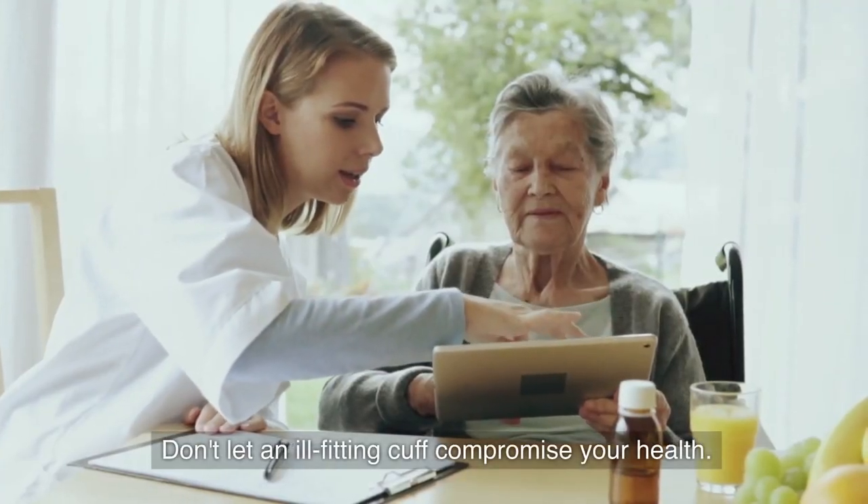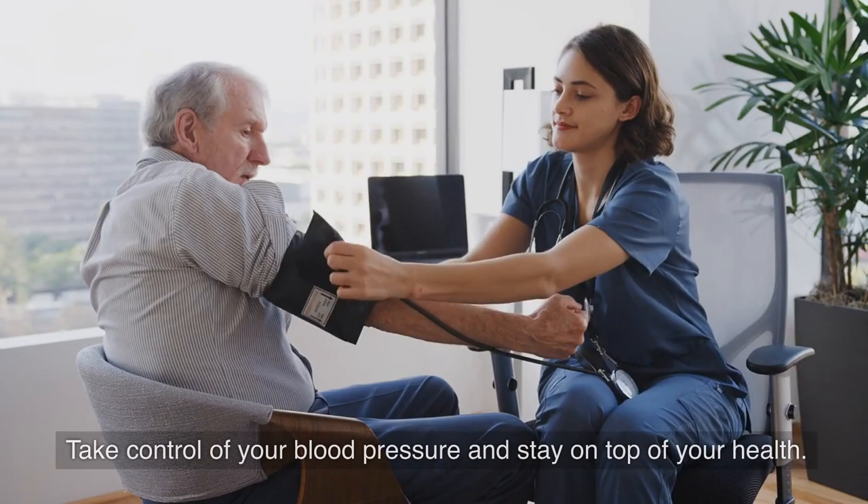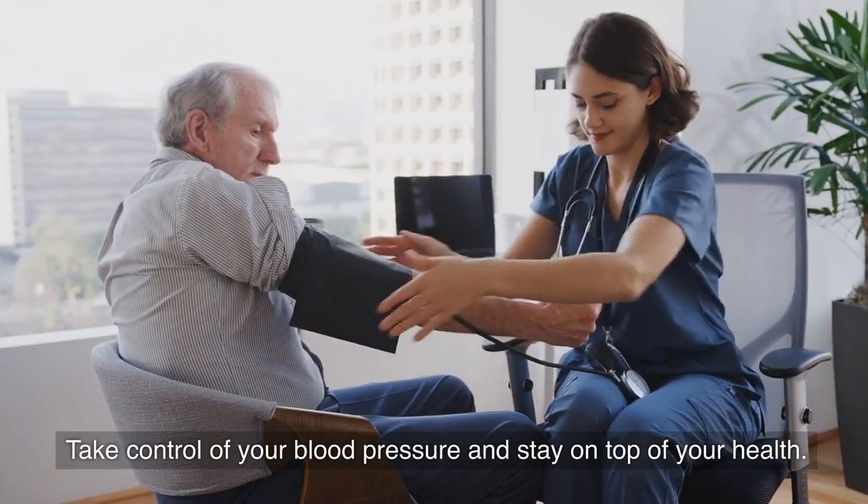Don't let an ill-fitting cuff compromise your health. Choose our big size cuff blood pressure monitor for easy and accurate readings. Take control of your blood pressure and stay on top of your health.